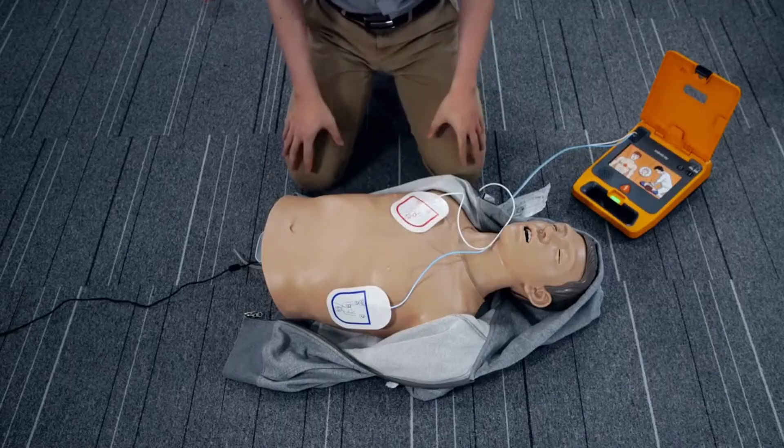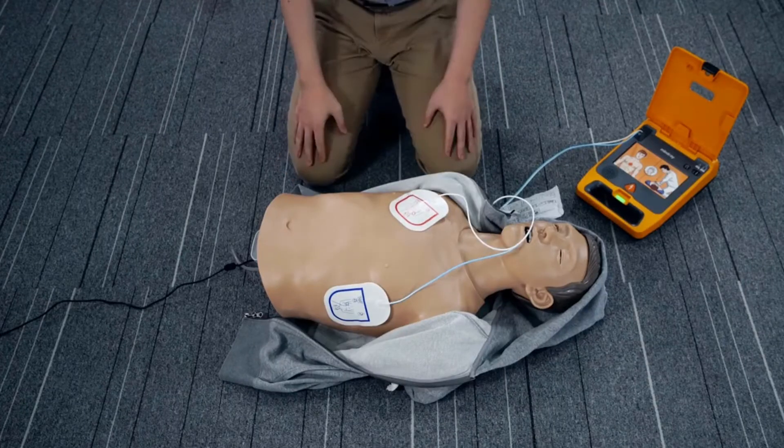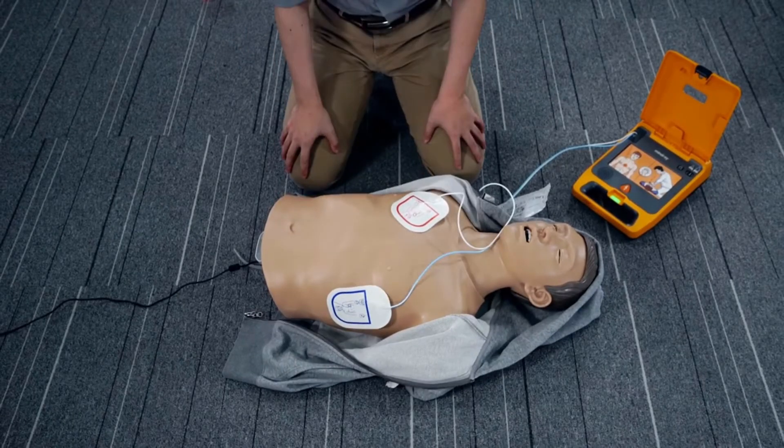Stop CPR. Do not touch the patient. Analyzing heart rhythm. No shock advised.